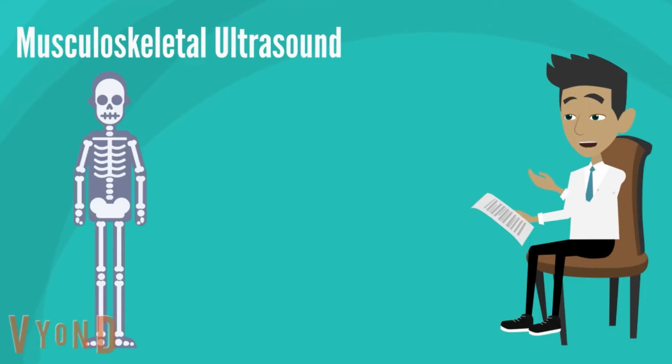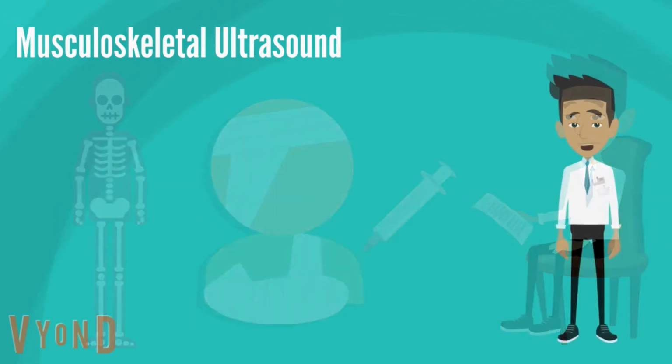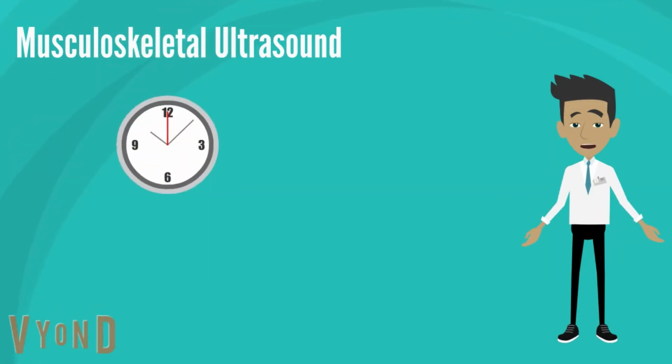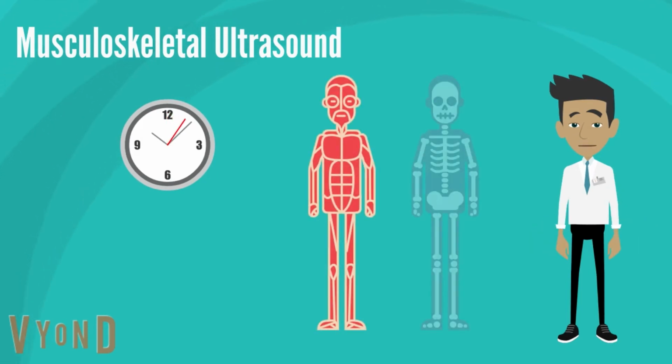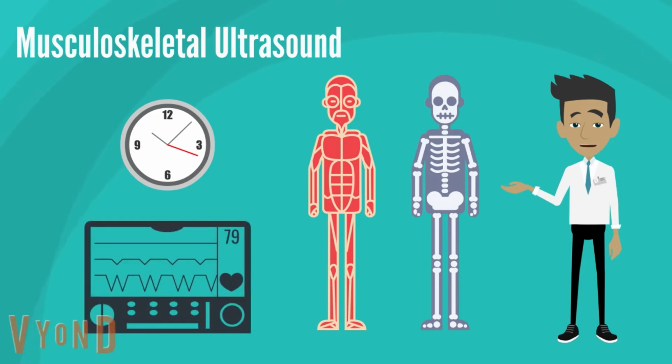In musculoskeletal ultrasound imaging, information is provided regarding the details of the tissue or organ being scanned. If any disorders are present, clinicians are often required to inject the patients with medication as a treatment. And ultrasound imaging plays an important role in this treatment as it allows the clinician to easily observe the changes occurring over time in the patient's muscles, tendons, ligaments and joints, which in turn allows for an appropriate diagnosis and the completion of the treatment of the patients.